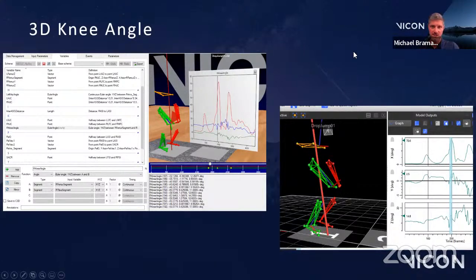Oh, I guess the other thing I wanted to touch on, and the other nice thing that's helpful, even if you're using an existing model, that I think is really nice about actually running through this practice is, a lot of times we are given predefined marker sets, but I see a lot of people struggle when they're trying to track something new or capture some new type of motion, maybe something like a robot, on how do we develop a marker set. So when we start going through this process of creating these models, we start to think more critically about where we're placing markers and why we are putting markers in this spot. When we're using something like Plug-in Gait, a lot of people just kind of accept it as it is. So they don't think necessarily about how marker position changes these outputs and how it is used to define these variables we're calculating. So it's a great exercise to go through and actually create these elements yourself.